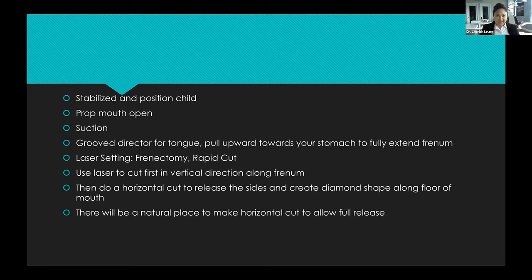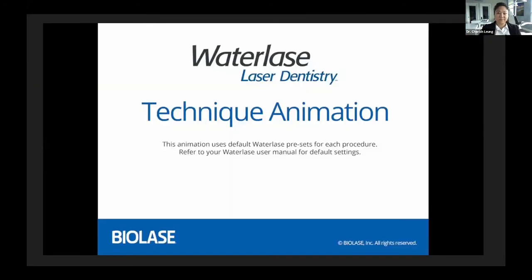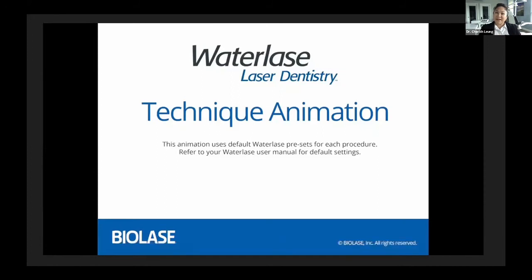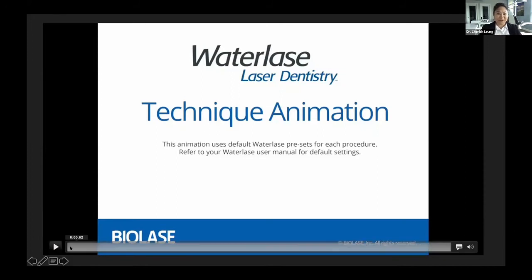And there's going to be that natural place. Like I said, when you pull, you can really see, okay, it's already starting to kind of buckle out on the side there. That's where I need to release to allow it to fully be able to move. This is Biolase's technique demonstration animation, so you can really see it. I actually find that it wasn't a full release in this video, but I'll show you exactly where. So it's actually a good demonstration.